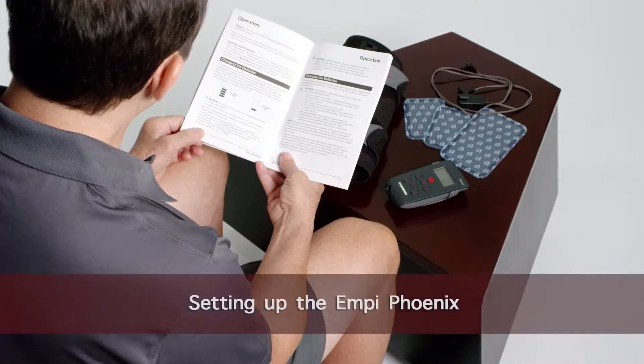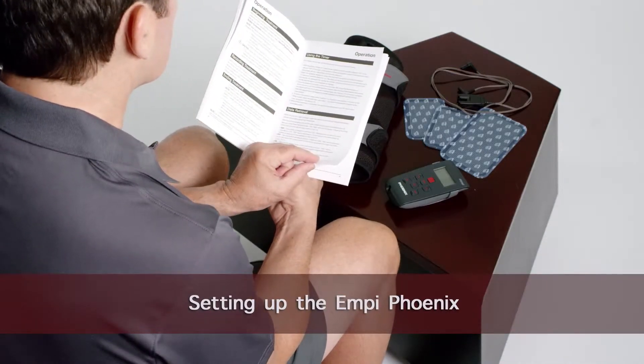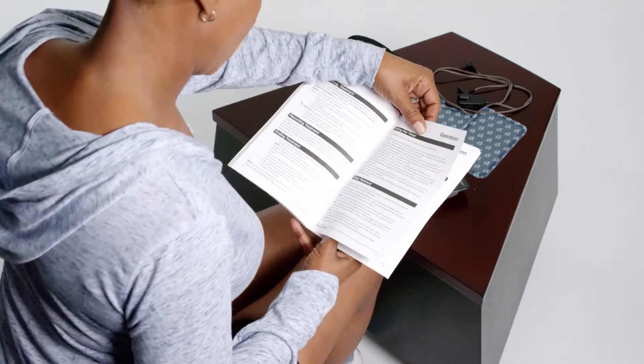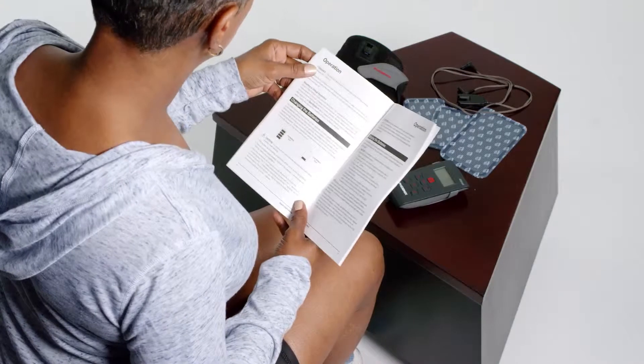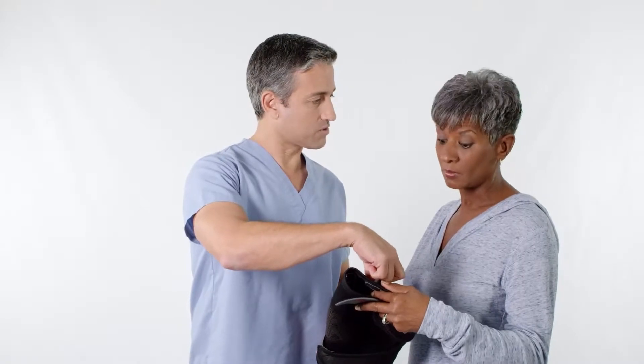Before using the device, it is important to read instructions for use, warnings, precautions, and contraindications found in your user manual. This device is intended for use under the direction of a healthcare provider. Your healthcare provider may provide specific recommendations for use depending on your condition.